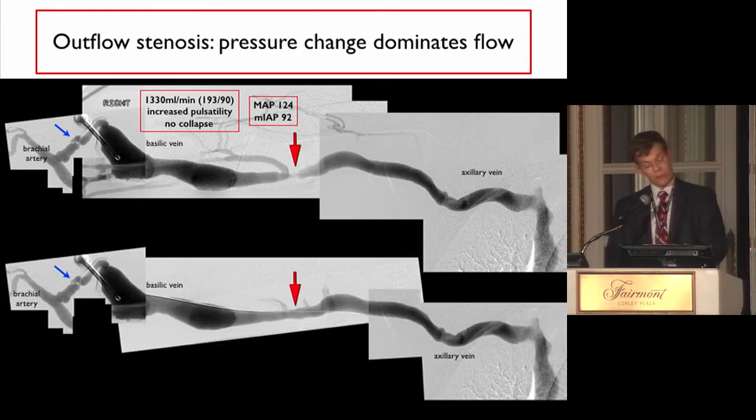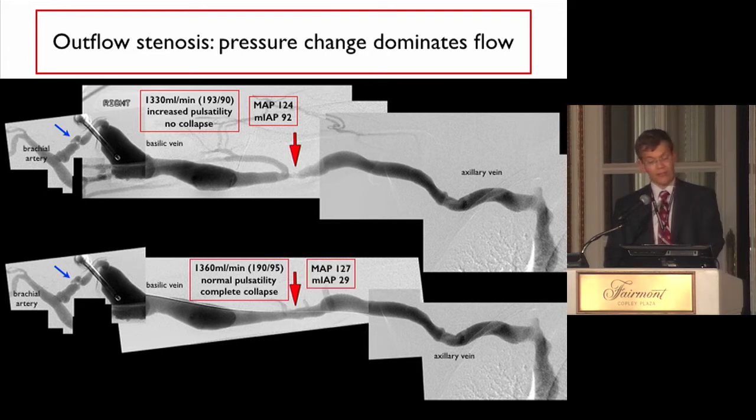If you do the angioplasty, you can see that the collateral vessel vanishes. The flow is almost unchanged. It's slightly higher, but the intra-access pressures drop significantly. So to treat this lastingly, this patient had a stent graft placed at that site of stenosis, and over years basically did not have further enlargement of the aneurysms.